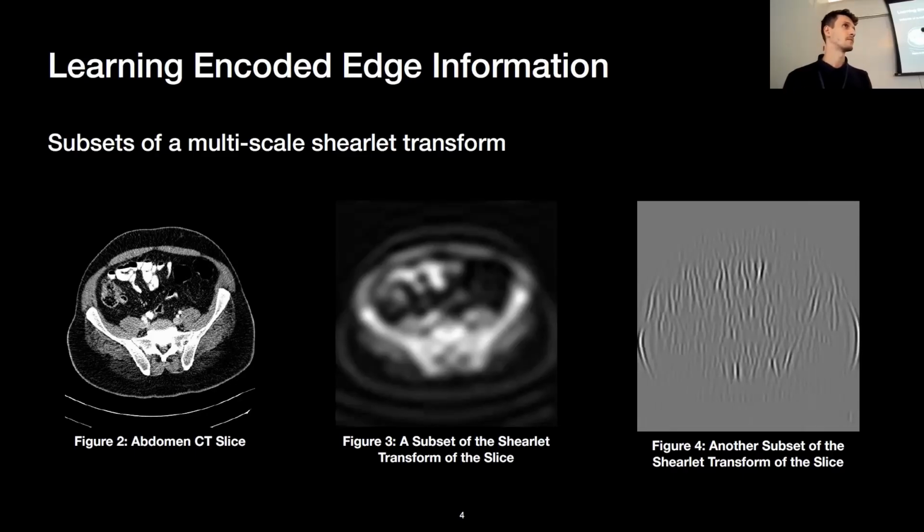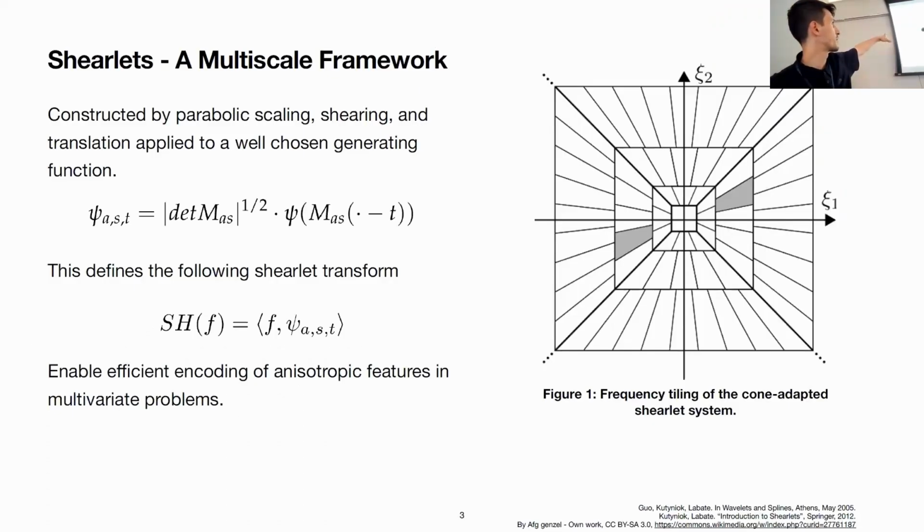Is it automatically generated, or can you tune it yourself? Is there a nice way to choose how large the stack is? It's a formula that depends on the parameters of the Shearlet system.